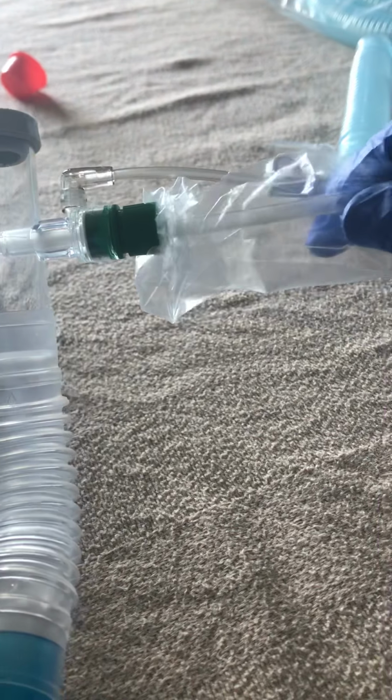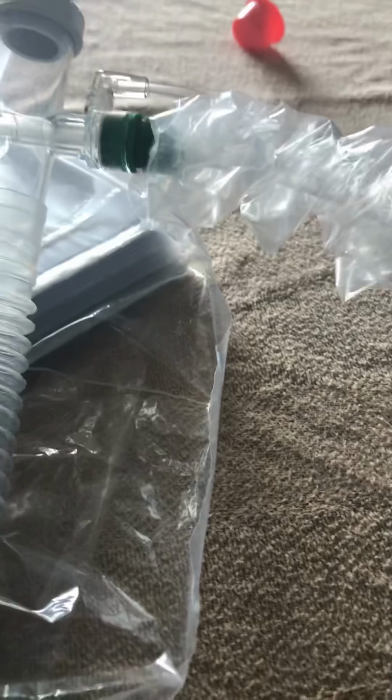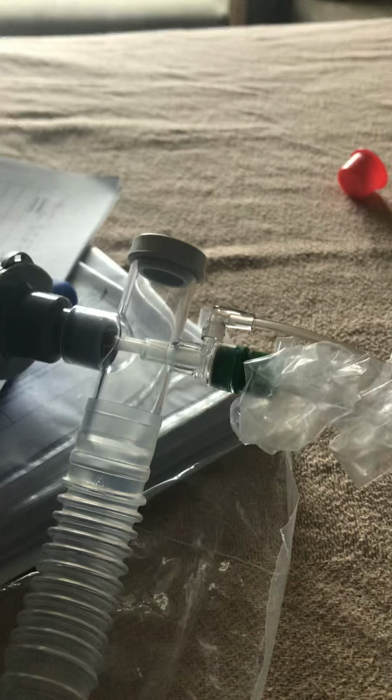The goal here is to not have this all bunched up, because when this is all bunched up, when we get to the end of this, we're not able to push the suction in anymore, so you're not able to get all the way down. So when we're doing it, we just want to do it nice and, it's hard to do with one hand, but we want to pull that plastic back and then stick it back in. Then when we're ready to suction, we're going to tell our patient, all right, we're going to make you cough, and then we pull that out.